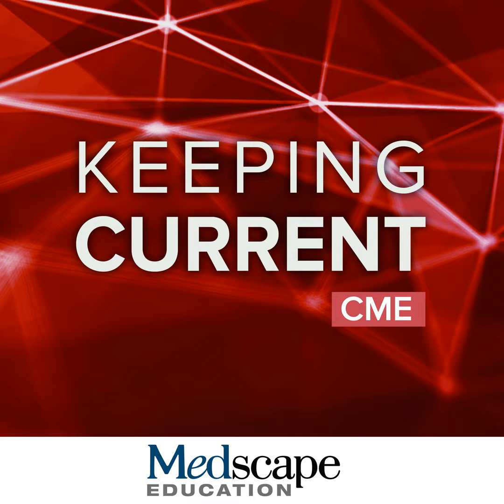And if the lesion is larger than 1 centimeter, you have to be more aggressive and consider easily a biopsy. If it's over 2 cm, biopsy; if it's 1 to 2, you can really consider early follow-up, and same thing, look at the threshold changes in size, and anything that grows over time is considered to be malignant and should, in theory, be biopsied.